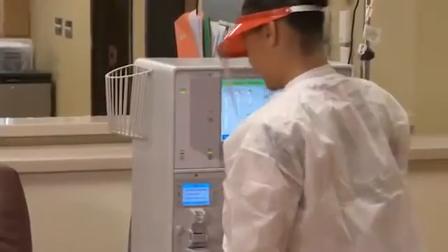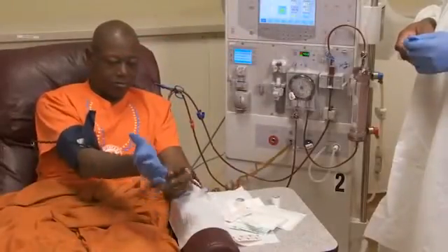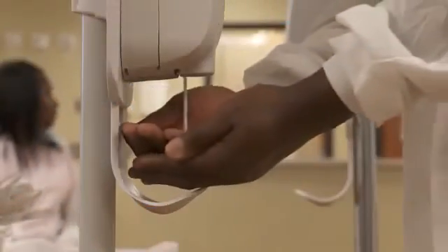When the patient has completed treatment, here are the steps for fistula or graft decannulation. Put on a gown and a face shield. Assist the patient with gloving if they will be compressing their access site. Perform hand hygiene and put on a new clean pair of gloves.